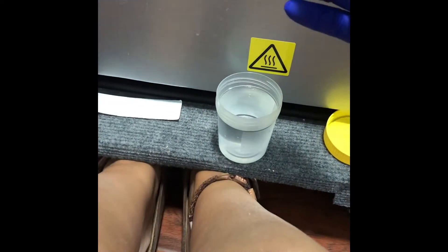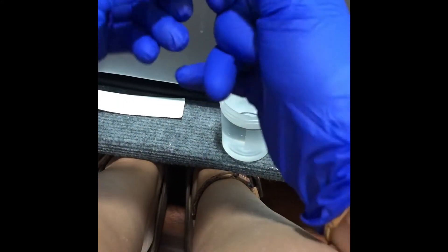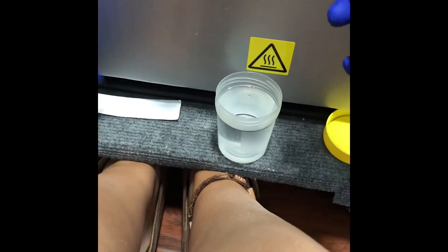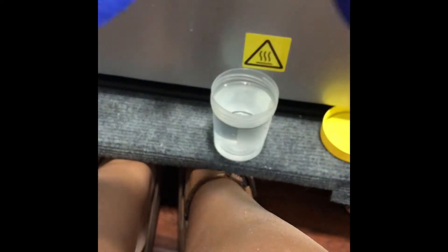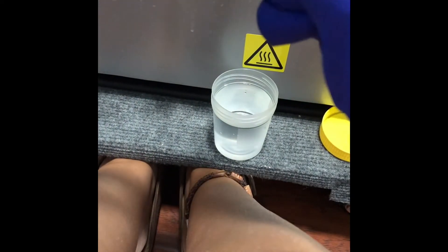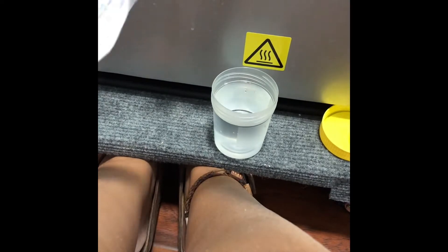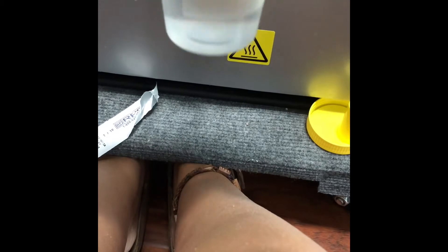So I will reconnect the lines and unclamp. Now I am going to remove the strip from its packaging and swirl it into the dialysate solution for about 15 seconds.